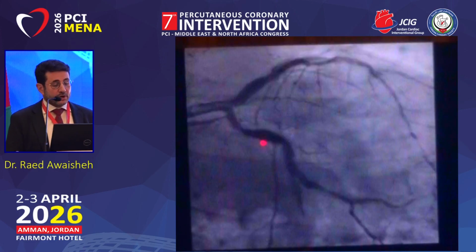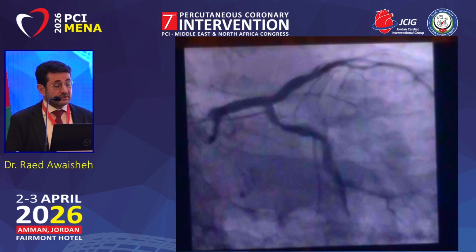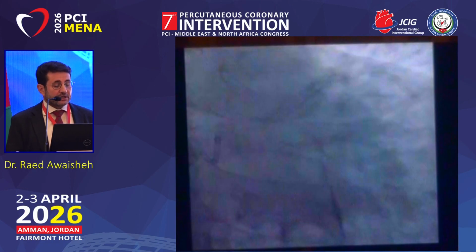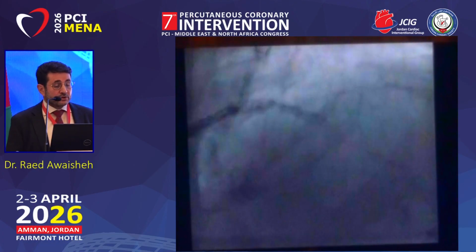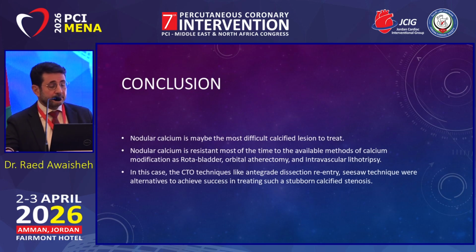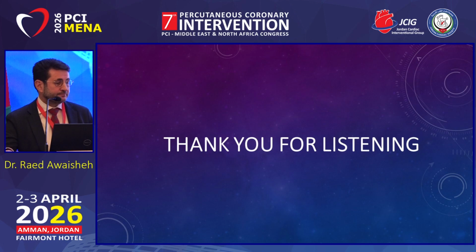This is the way CTO operators actually deal with the external. We have many cases. In the next session, we will show how to go with the ADR and extra plaque approach. So this is the conclusion of my case. Nodular calcium actually is one of the most difficult enemies inside the cath lab. Most of the available tools at the moment sometimes don't work, and in this way you can use this extra plaque approach as a technique to overcome this problem. Thank you.